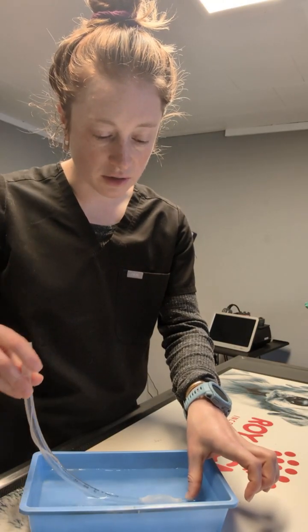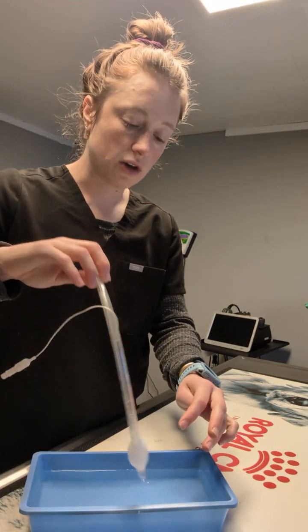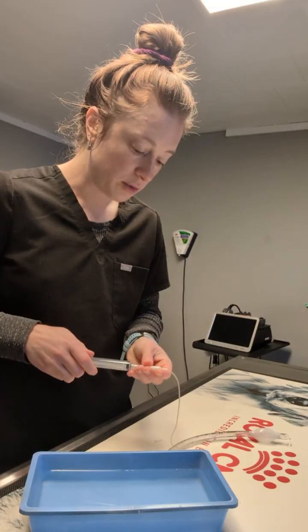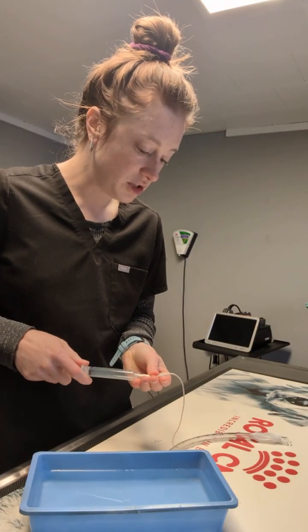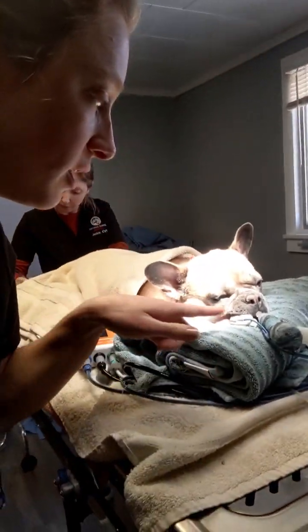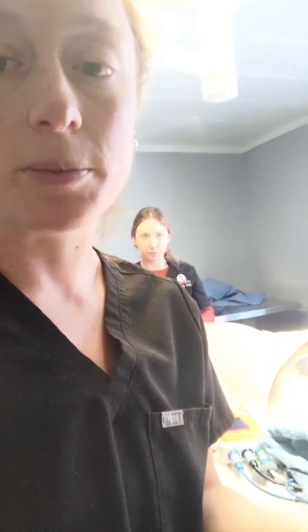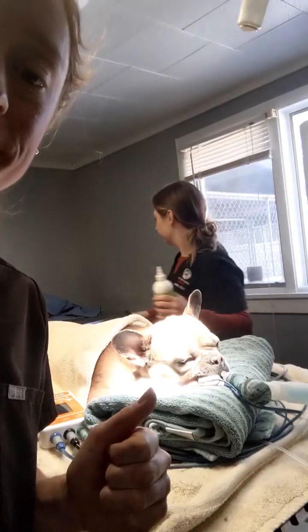After a few seconds under the water, I'm not seeing any bubbles or anything. So this should be good to use on a patient. Go ahead and remove the air. Make sure it deflates normally too. So we've got the respiratory monitor hooked up between the endotracheal tube and the breathing tube. The way it works, when air moves through it, it makes a sound to indicate breathing. So it helps us monitor her respirations throughout surgery.